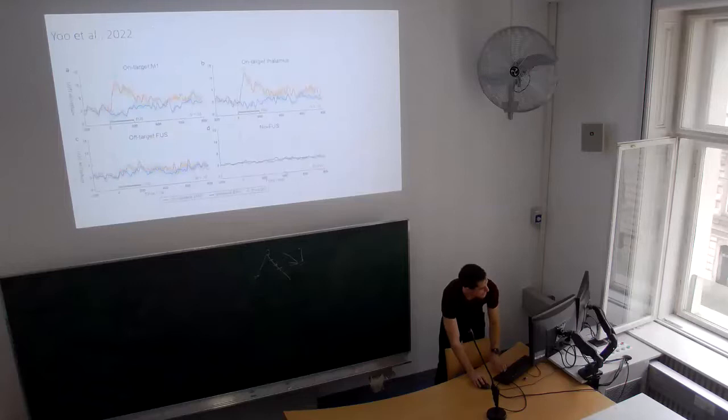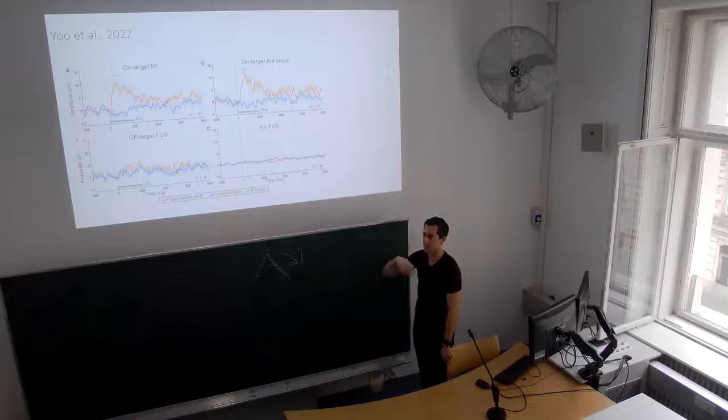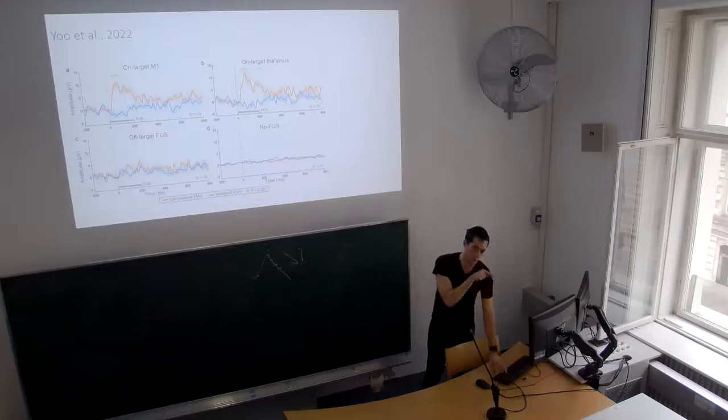Here's another, more recent study, 2022. That's really good, very detailed, and they did it in sheep. Same sort of thing. What's nice is they have off-target examples. So it's not about the ultrasound being on. It's not the sound it might generate. It's nothing to do with bone conduction of sound or pressure waves or anything like that people might point to with the early animal studies. Instead, it definitely has to be direct neuromodulation. This study also really confirmed that duty cycle thing I'm talking about.